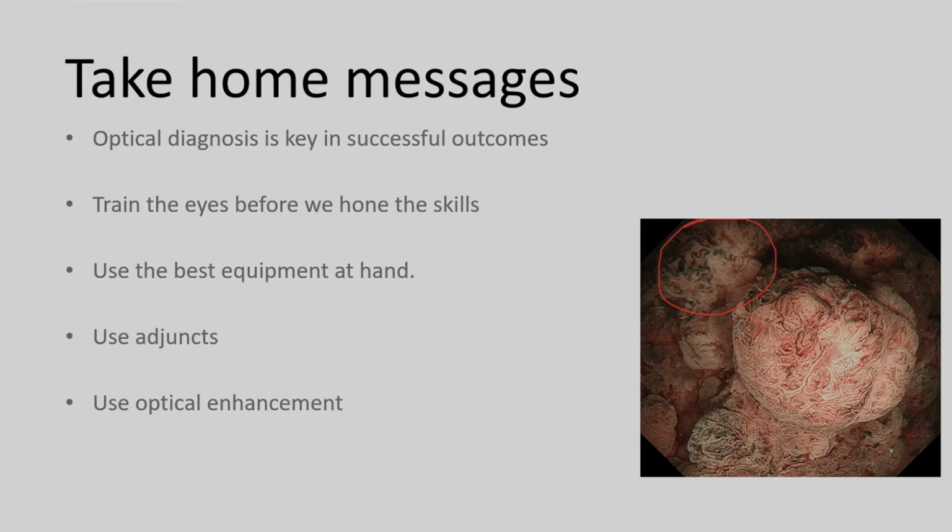My suggestion is to use the best equipment you have in the unit, whatever it is, use the best adjuncts you have, whether it is your transparent cap, stains or any other dyes. And use optical enhancement techniques, that is zoom techniques, for example, if you have.